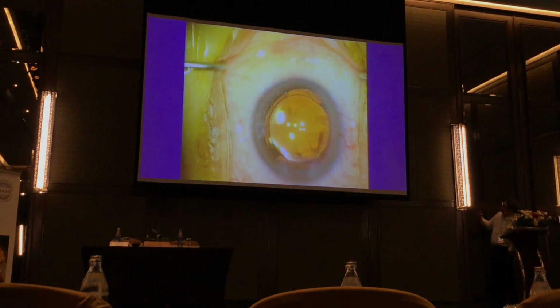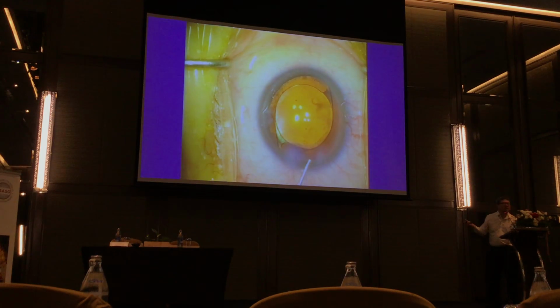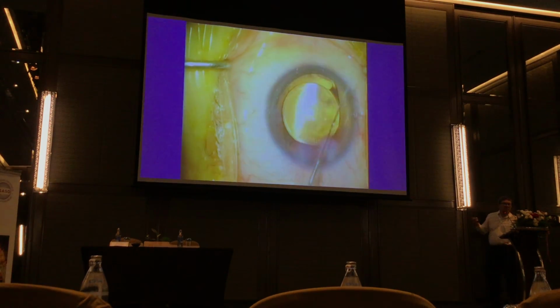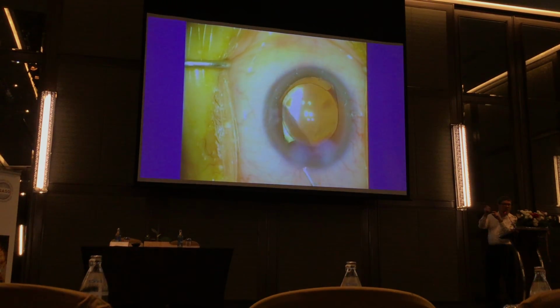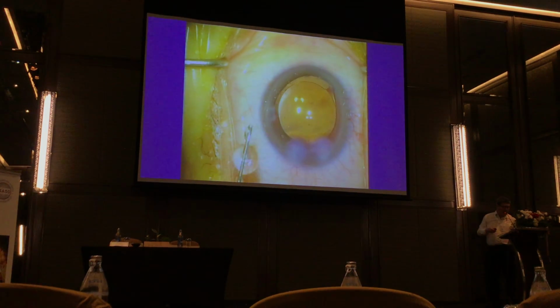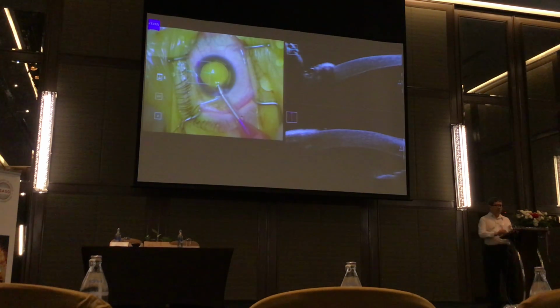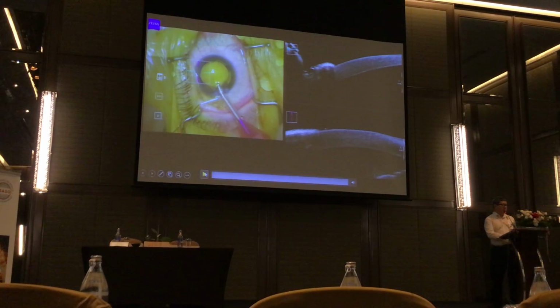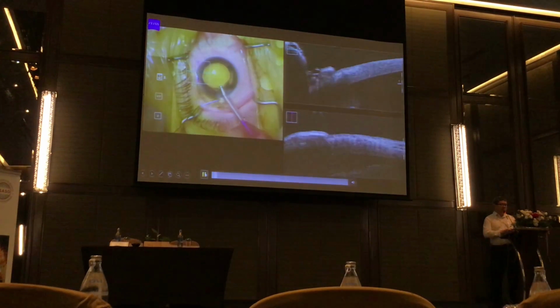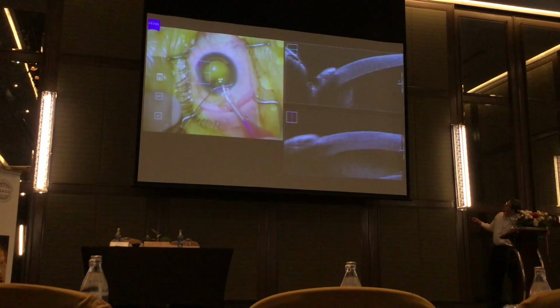And the other thing I do, of course, which I showed earlier, is when you come out, you can see there's still a bit of shallowing, but it's a gentle one. It's not so abrupt. I sometimes, as I withdraw, put my finger or a cotton bud there, and that also helps protect the anterior chamber. So you can see here, removing, pressing.